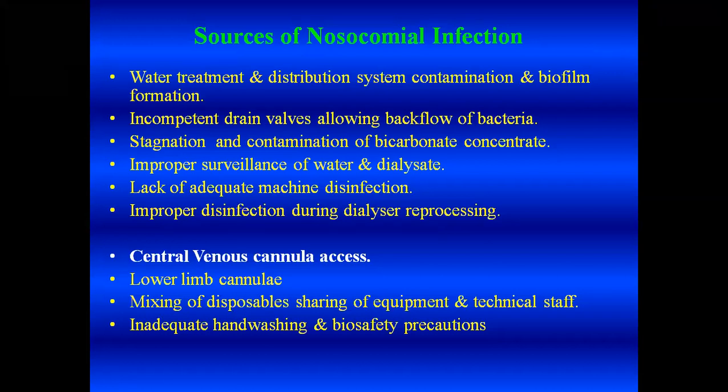So, one reason is preparation. The other is that nurses and technicians feel that it is wasteful to throw away a half-used jar of bicarbonate, because fewer dialyses were done in the night session, and they will keep the jar over to use the next morning. So we have a very strict rule that all bicarbonate is to be poured away in the night. The bicarbonate mixer, if you have a mechanical stirrer for preparation of bicarbonate, is to be emptied at night and then cleaned and disinfected before fresh bicarbonate is prepared in the morning.